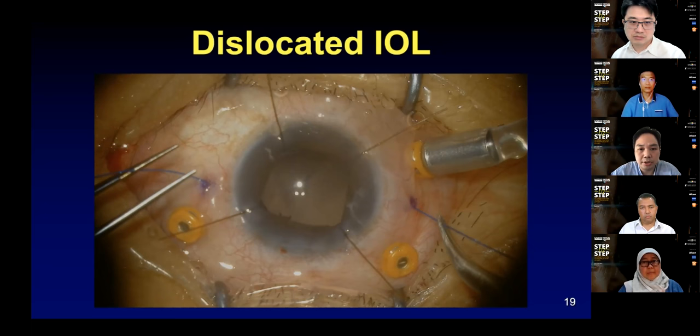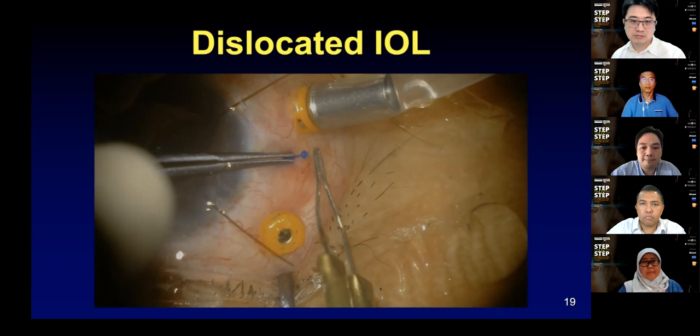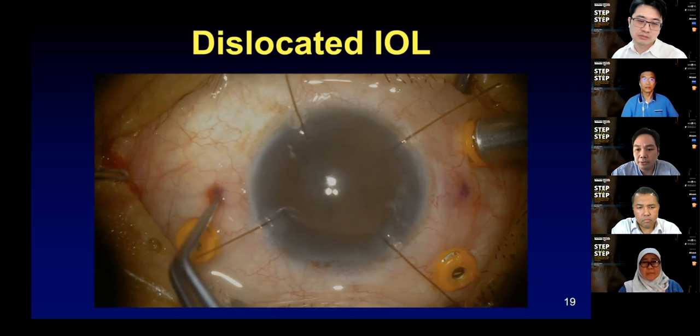Now the issue now is to create the correct size so that you can get it flush and subconjunctivally and secure the lens safely. So as I mentioned, probably around about 2, maybe 3 millimeters with a 6-0 proline to get a good size nub, which can actually sit flush or subconjunctivally without eroding through and hold the IOL in place. And that looks pretty good at the end of the case.